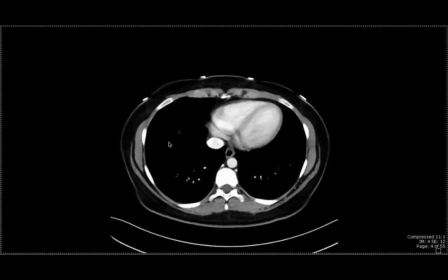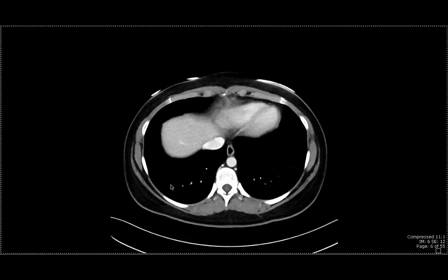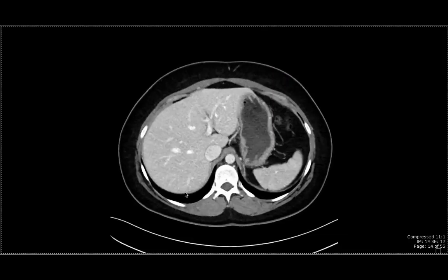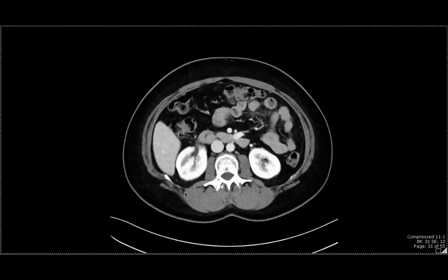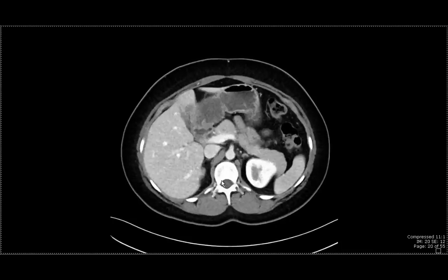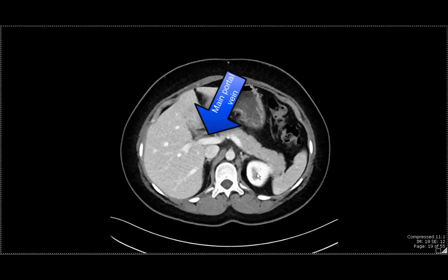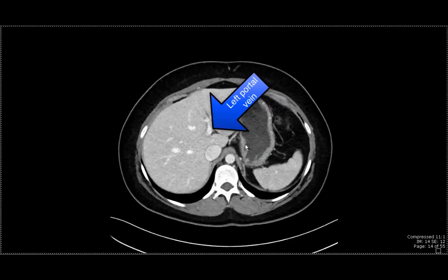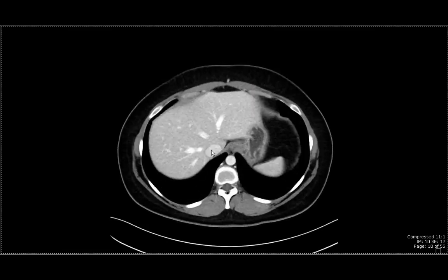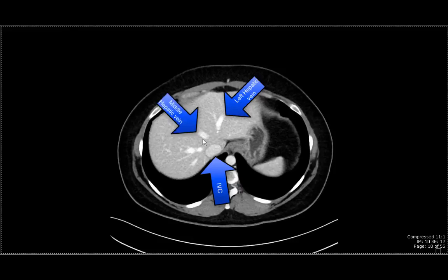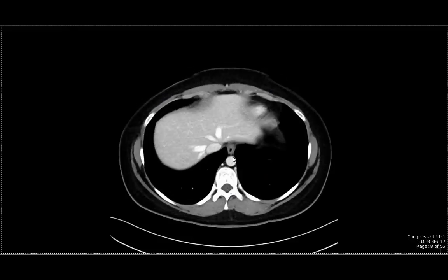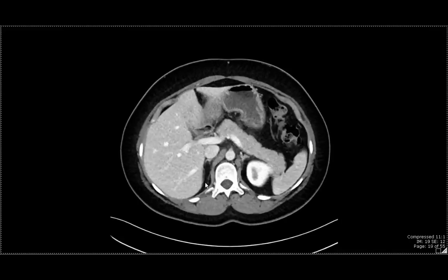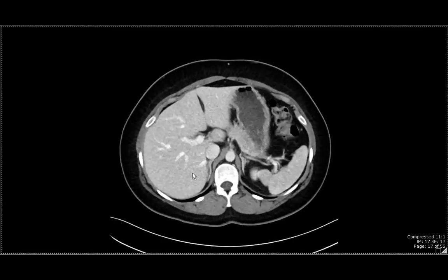We're going to scroll up and see the liver — we can see the liver dome over here. This whole structure is going to be the liver with multiple vessels running through it. Some of these vessels include the main portal vein, which goes into the liver and splits into the right portal vein and the left portal vein. We have multiple structures draining from the liver into the inferior vena cava: the left hepatic vein, middle hepatic vein, and right hepatic vein. This person also has an accessory hepatic vein coming from the right hepatic lobe, draining directly into the inferior vena cava.